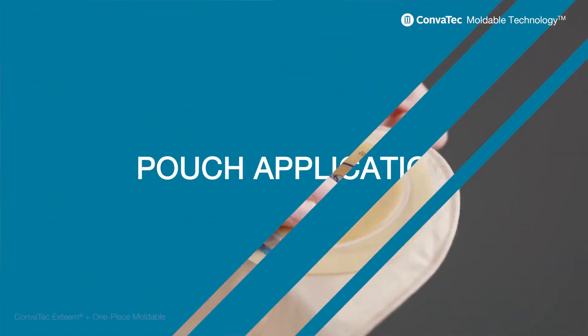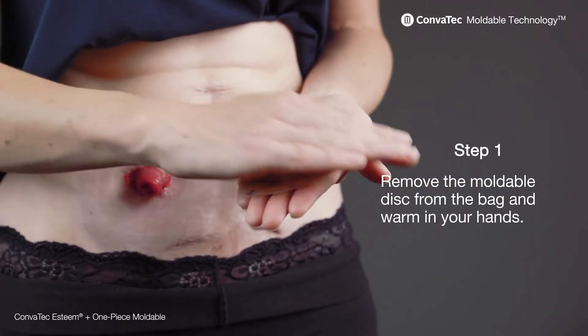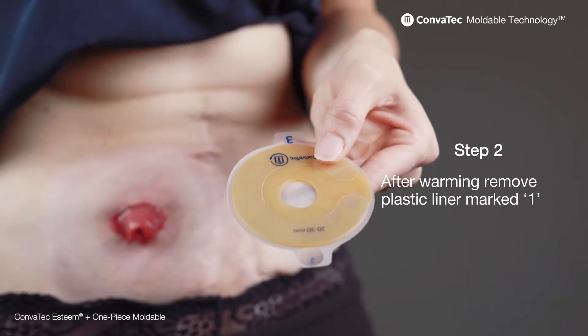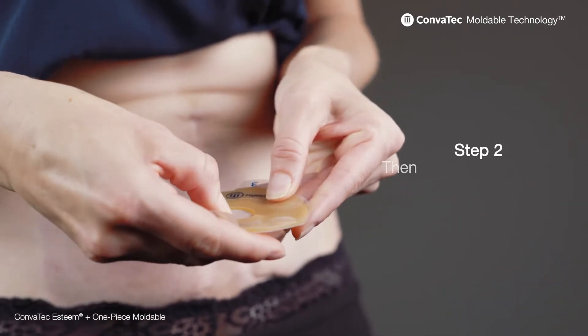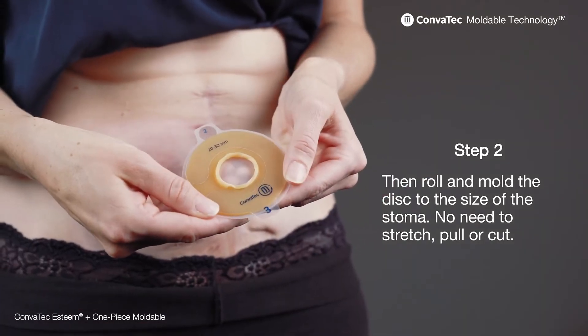It's really easy. Step one: remove the mouldable disc from the bag and warm in your hands. Then step two: after warming, remove the plastic liner marked with one. Then roll and mould the disc to the size of your stoma. Do not need to stretch, pull it or cut.